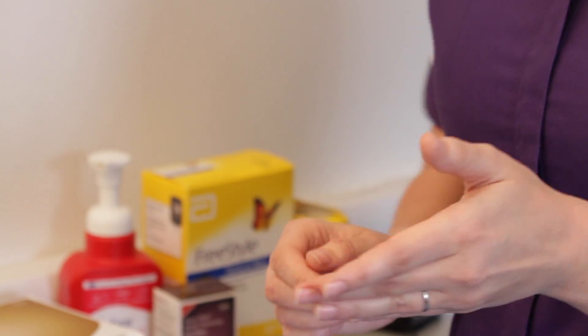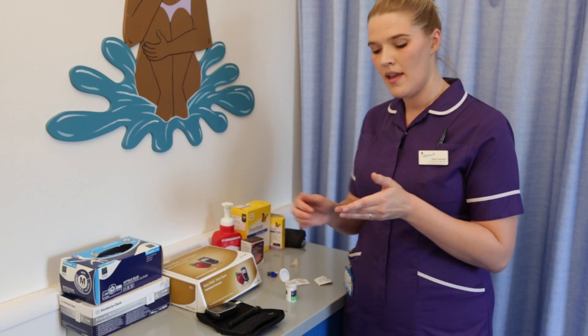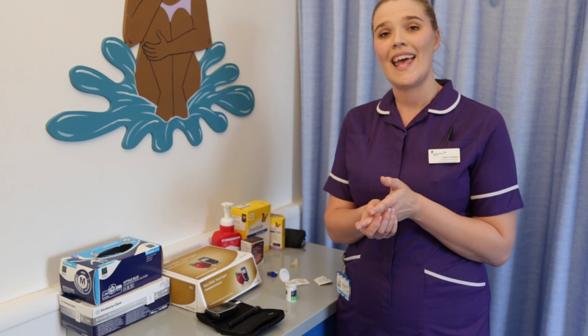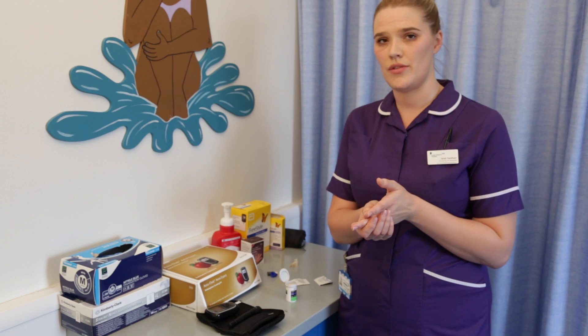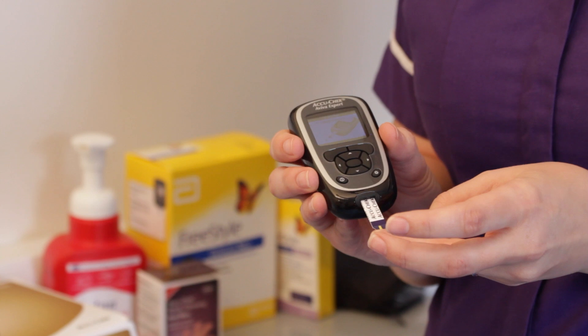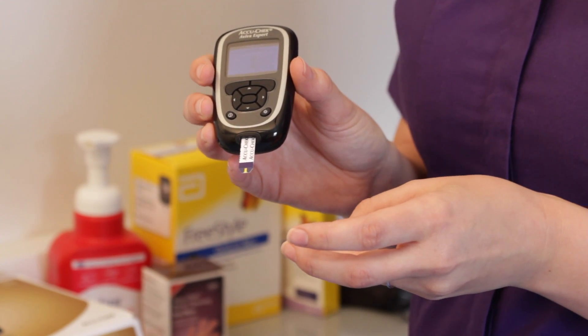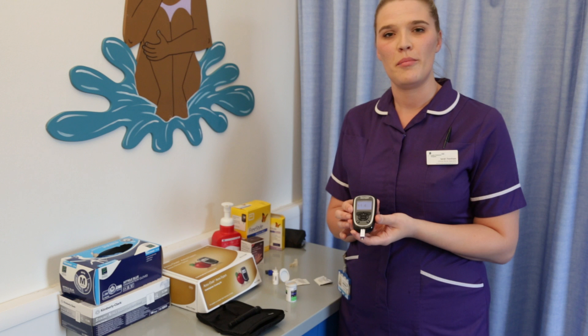You should then have a small drop of blood at the end of your finger. Wipe this away — this is so that we've eliminated any possibility of there being anything extra on that finger. Take your blood glucose meter and touch the straw end to your blood, and a reading will appear on your screen.